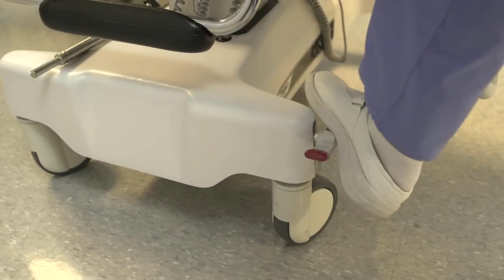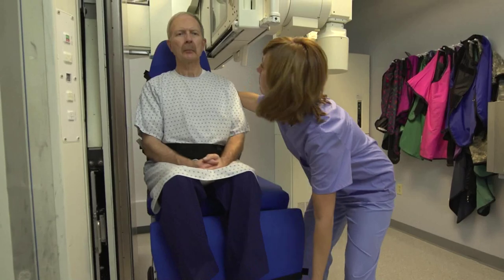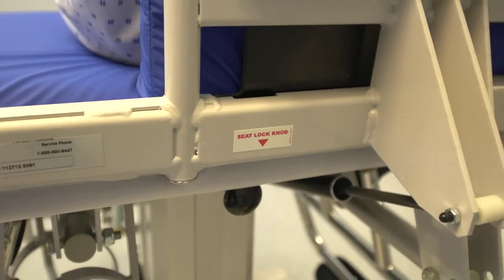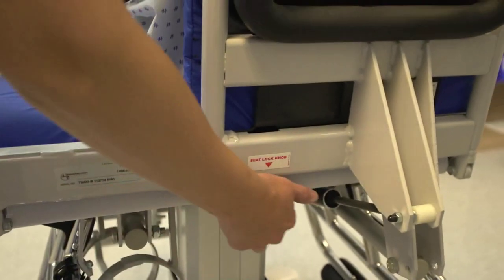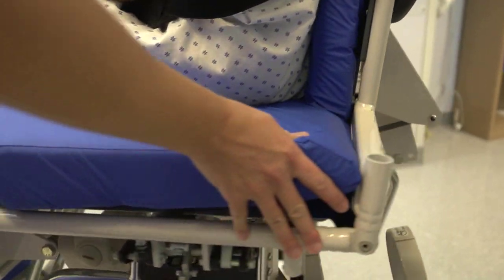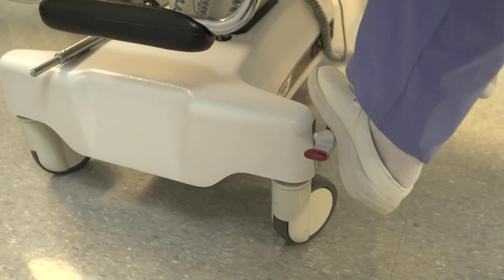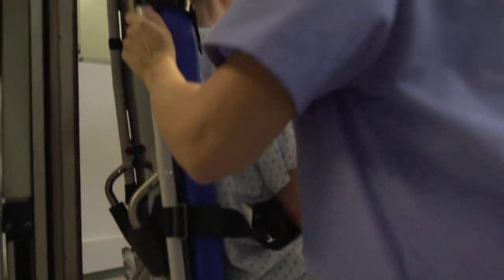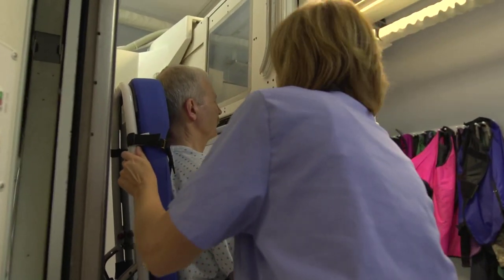For the AP view, unlock the brakes and roll the chair from the RF tower, then lock the brakes. Raise the chair to its maximum height. Release and lower the push bar. Next, pull the seat lock knob located at the back of the chair and rotate the chair counterclockwise until it locks into place. Unlock the brakes and roll the chair into the RF tower. Now you're ready for the AP view.